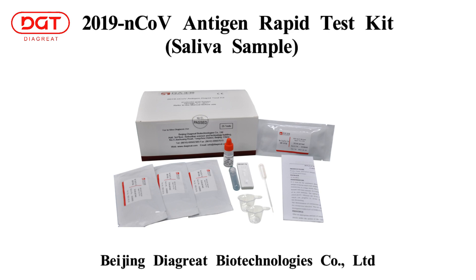Welcome to watch the DIGRE 2019 ENCOV antigen rapid test operation video. Through this video, you will learn how to operate the test with a saliva sample. For more information, please check the manual.